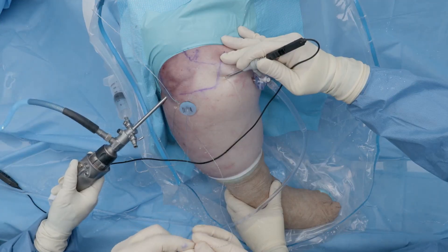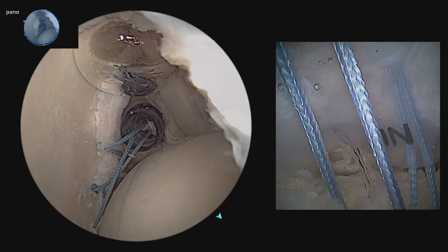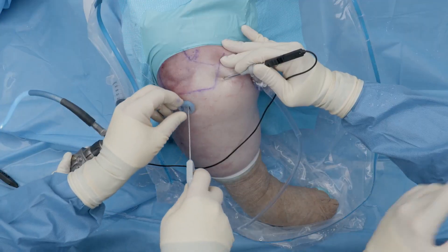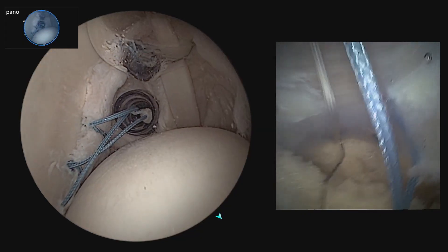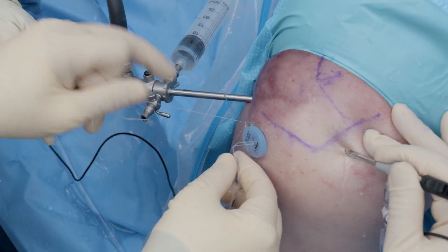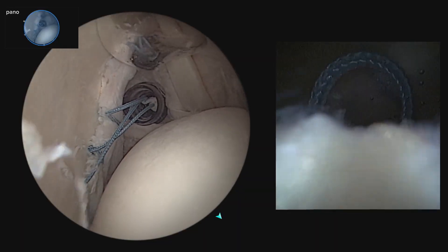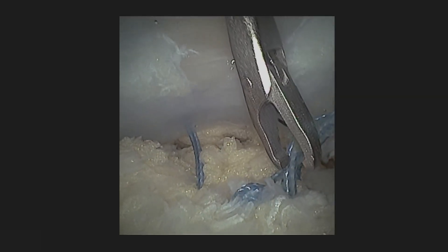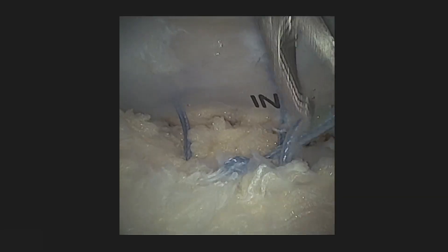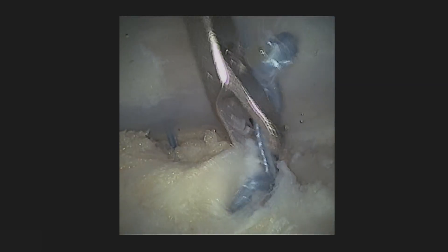We convert both anchors and get them ready for tensioning. If we're not getting good visualization from the lateral portal, we can easily move the nanoneedle to the anterior superior lateral working portal already established — that is one of the beauties of the nanoneedle: we can change position very easily to get better visualization. Before fully converting, I make sure there are no loops or knots, giving each loop a little pull to confirm there's no twist in either of our convergence stitches.